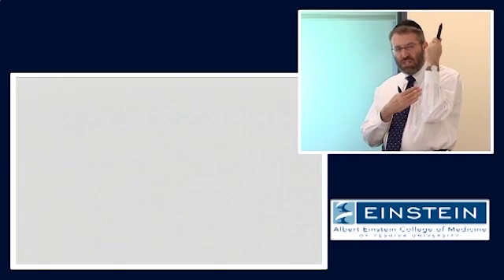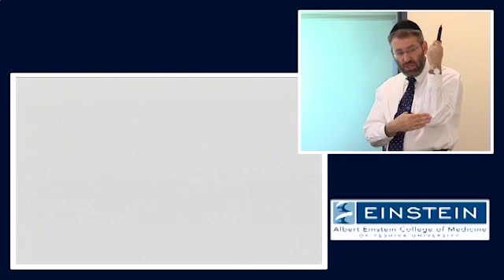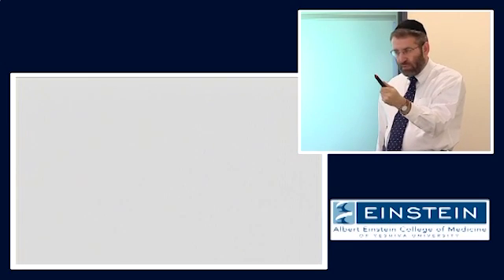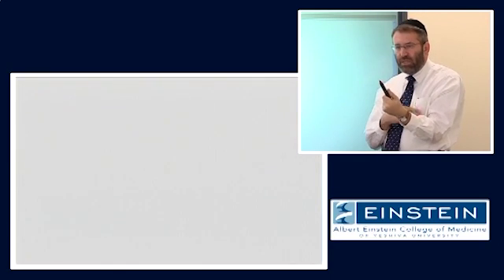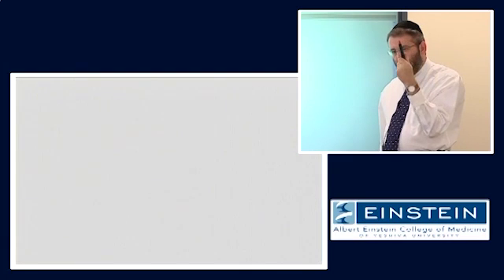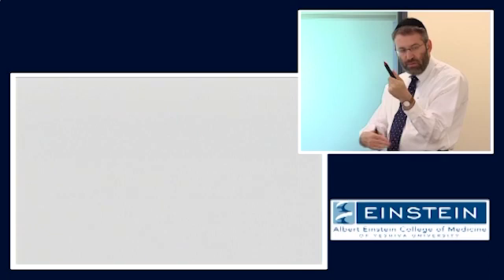Well, by changing the amount of RF power that I apply to the patient, instead of flipping this 90 degrees, I could, let's say, only flip it down 45 degrees. That's simply a matter of either cutting the B1 power in half or applying the same strength for half the amount of time. If I put this down to 45 degrees, I've now created less signal than if I put it all the way down to 90 degrees.